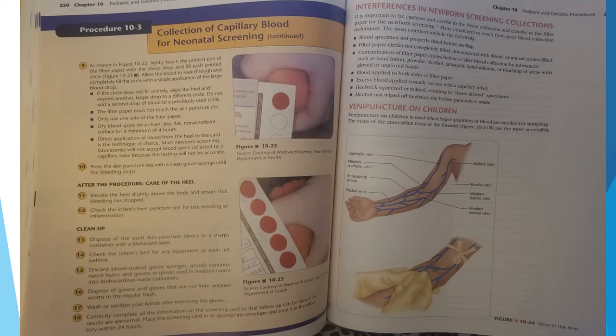After the procedure, care of heel. Elevate the heel slightly above the body and ensure that bleeding has stopped. Check the infant's heel puncture site for late bleeding or inflammation. Cleanup. Dispose of the used skin puncture device in a sharps container with a biohazard label. Check the infant's bed for any equipment or trash left behind. Discard blood-soaked gauze sponges, grossly contaminated items, and gowns or gloves used in isolation rooms into biohazardous waste containers. Dispose of gowns and gloves that are not from isolation rooms in regular trash.